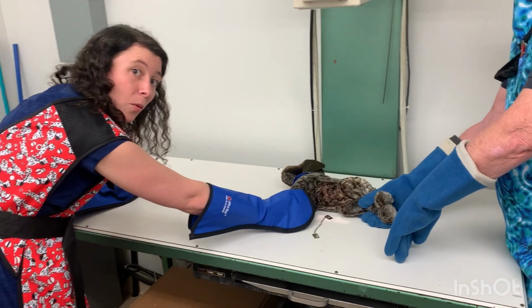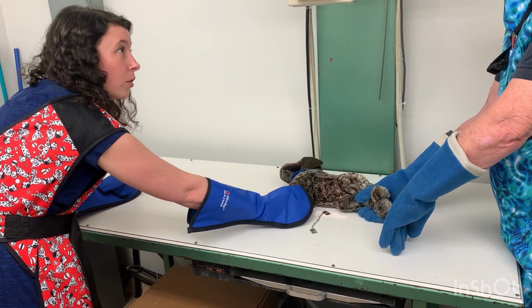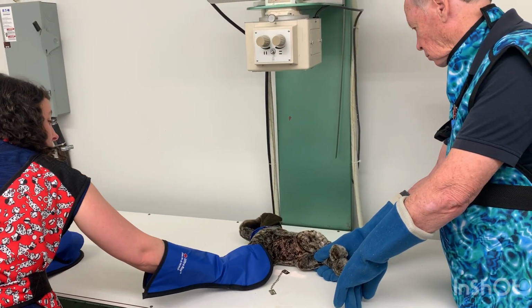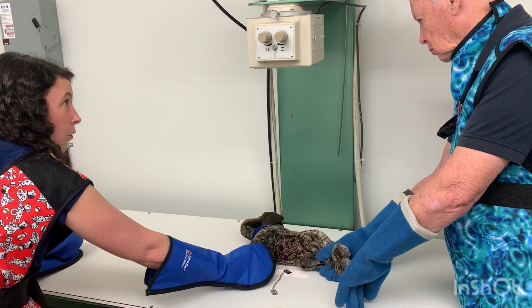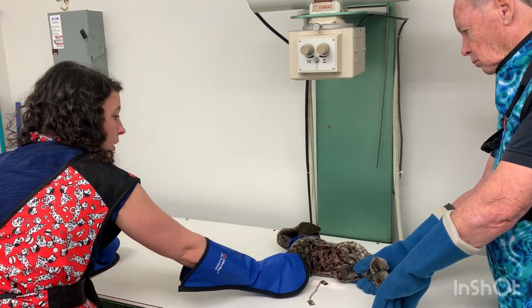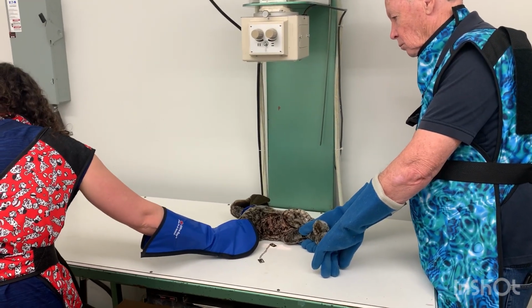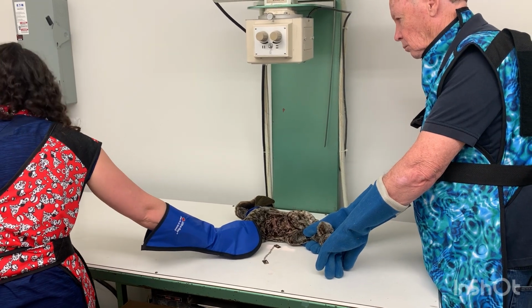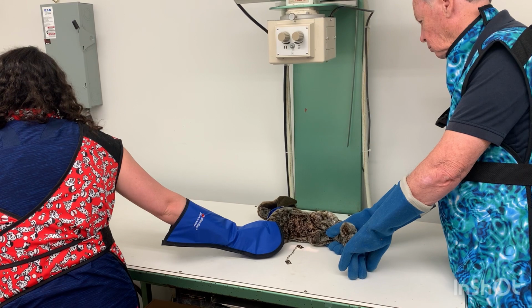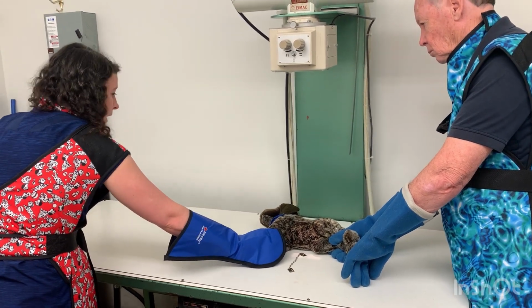The important thing is when we're actually taking the exposure, so we're going to pretend like we're taking the exposure now, is that Dr. White and myself, we're going to be looking away and turning our bodies away as much as we can from the patient and from the exposure, so that way we get less scattered exposure. So we're holding on here, it's great. And then our patient's fairly straight. We're going to be pressing down now, look away, turn your body away. Okay, pressing down and holding for a few seconds. Okay, then pressing down fully, then the exposure is actually taken.